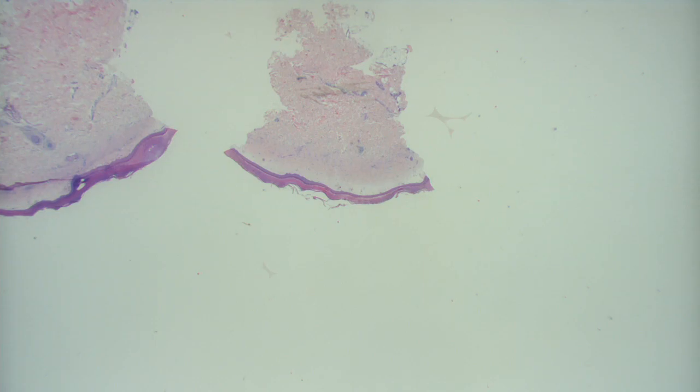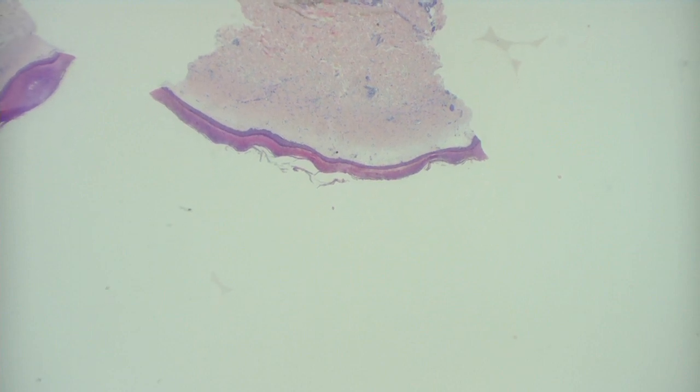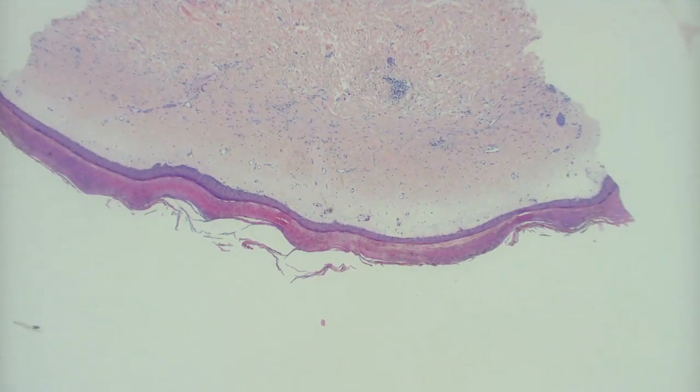All right, this one is a fantastic one. So this is a punch biopsy. The stratum corneum is bright red and compacted, and then there's a papillary dermis pattern, and there's some lymphocytic infiltration below that, but it's not a thick blue band. Yeah, it's pretty much gone away. Good. On higher magnification, I did notice there were some dilated superficial vessels within the dermis.